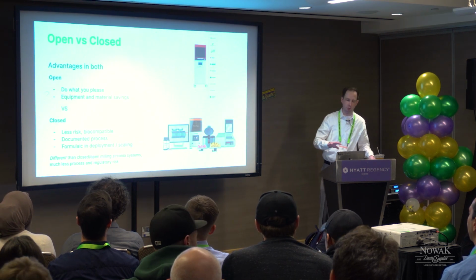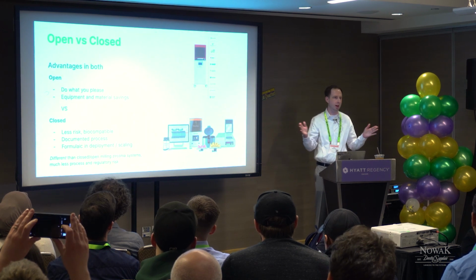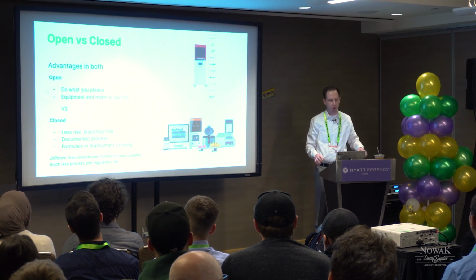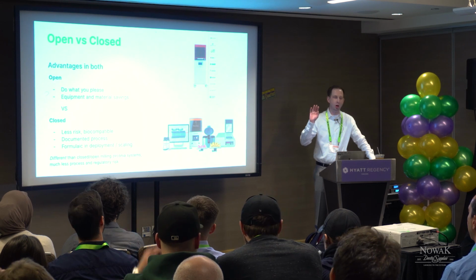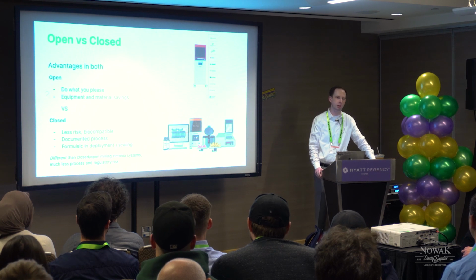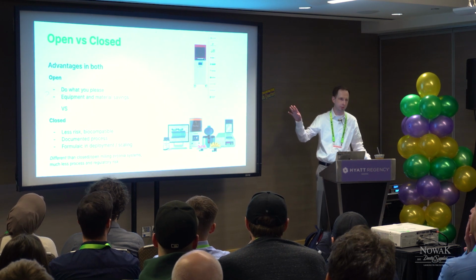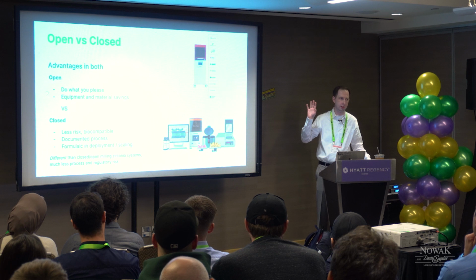That's what it's doing. Open and closed. So I'll preface this section a little bit. We all remember the open and closed mill wars of 10 years ago, when you had different disc sizes, D-shaped ones, and it was open and closed, and they were fighting. This is much different than that, because zirconia systems are much less risky in process and regulatory. Even if a zirconia crown is sintered 100C under, which is like worst case, or over, it's probably going to be okay, right? That is not true for 3D printing. If you send out an uncured part, it is a long-term risk, guarantee it. These things can be dangerous, toxic.